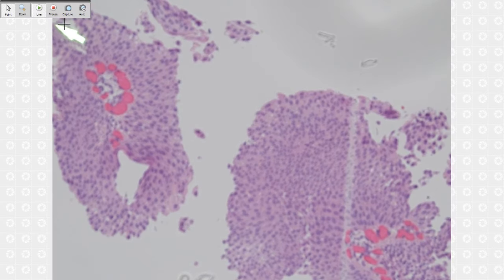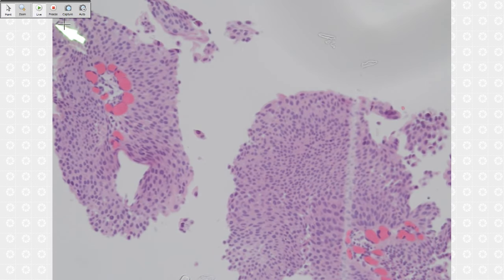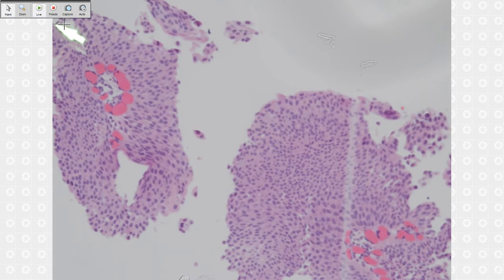So if this patient has no history, a relatively young patient, right? Probably you call it low grade, nothing wrong. If I call this low grade, nobody will argue with you. But in this scenario, a first biopsy, with no obvious mitotic figures and nuclear pleomorphism not that obvious, I usually call PUNLMP, papillary urothelial neoplasm with low malignant potential.